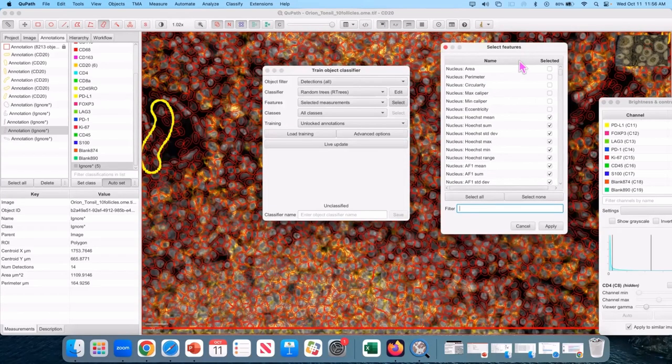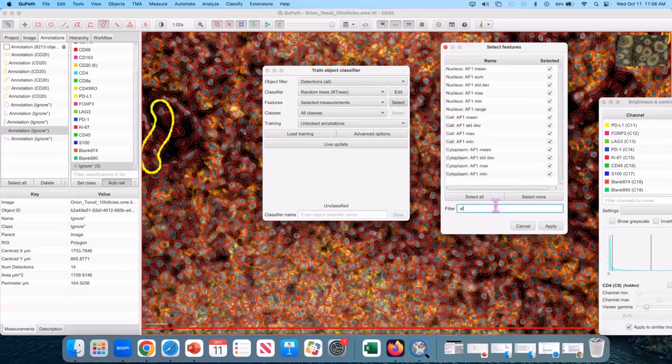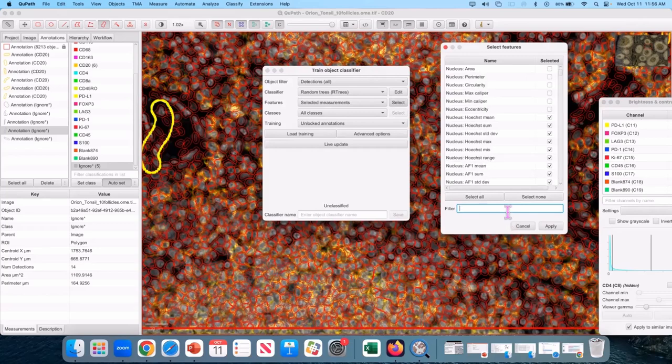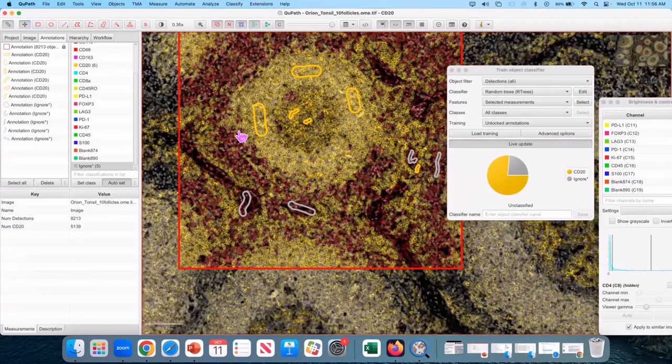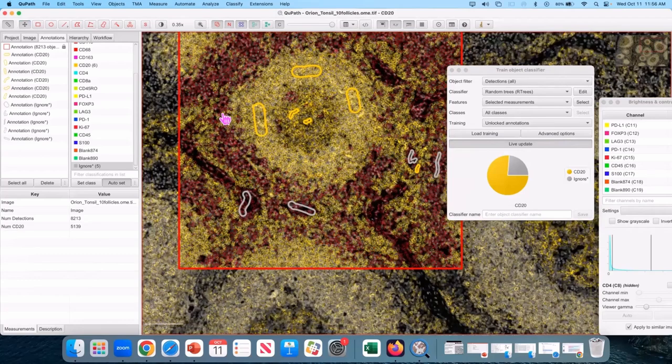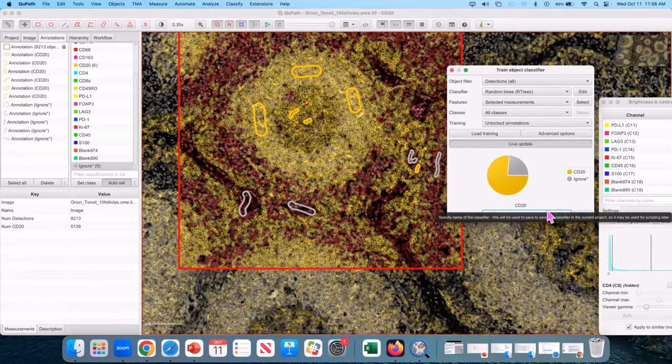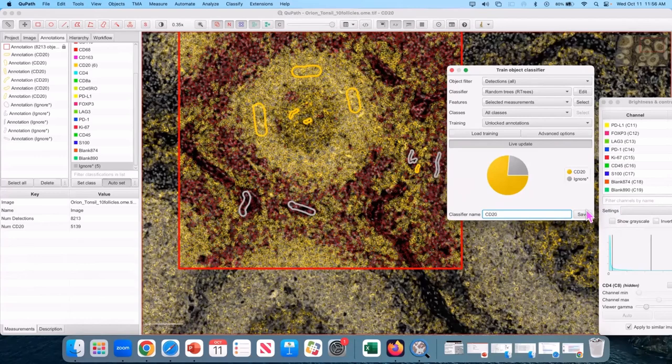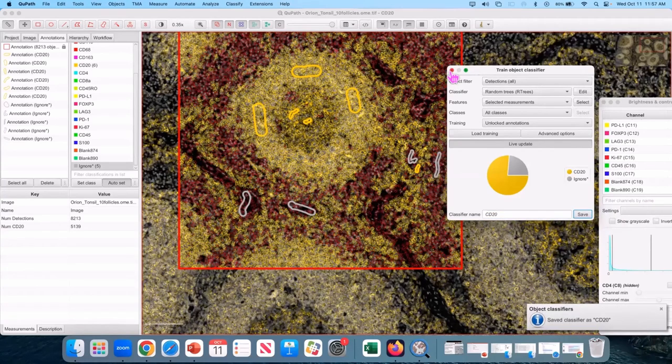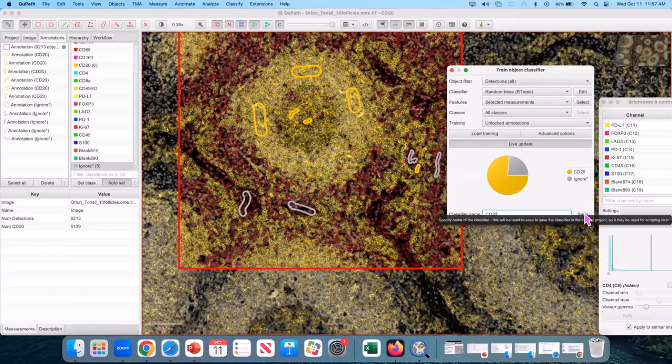Once again, when you're selecting features, you have to take whatever you're going to type, select what you're going to select, and then delete the text here. If I were to hit apply right now, it would actually only use the autofluorescence channels. You have to go back to the full list and then hit apply. So like I said, the point of this isn't to get a super accurate B cell classifier. It's just to set up a classifier that works well enough that you'll understand what the cells mean. So I have my CD20 classifier. I labeled it CD20. I hit save. This is now written as a JSON file.